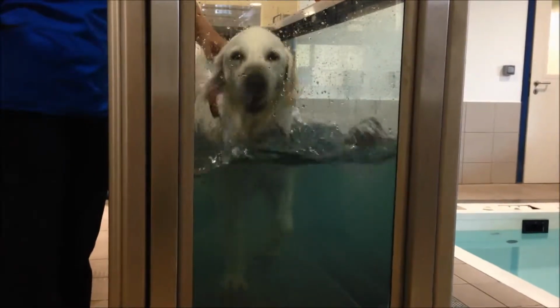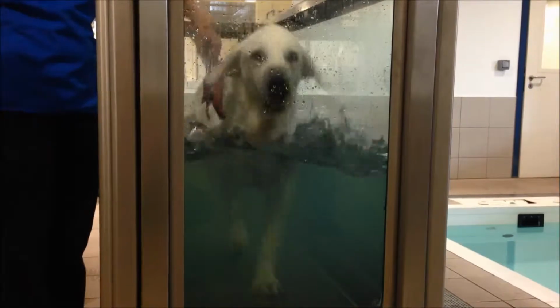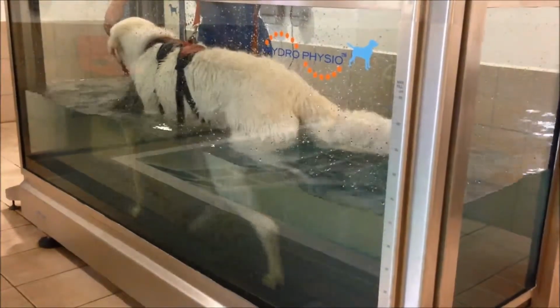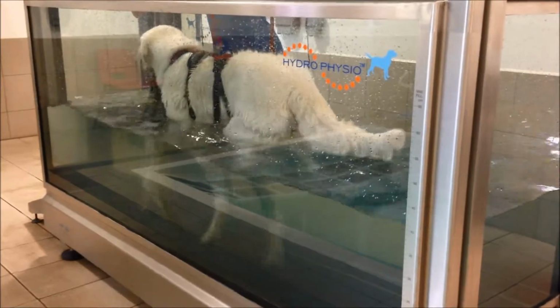Riley came to physiotherapy initially weekly for the first 8 weeks. This consisted of work on the treadmill and a home exercise plan and a gradual increase in walking exercise. After the 8 weeks of weekly, Riley dropped down to fortnightly physio and is soon going to be dropping to monthly.